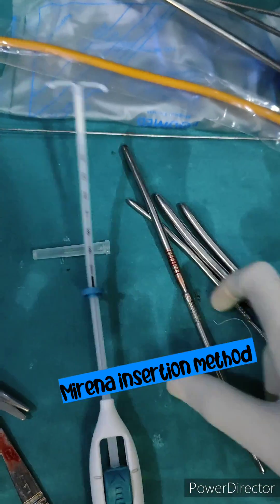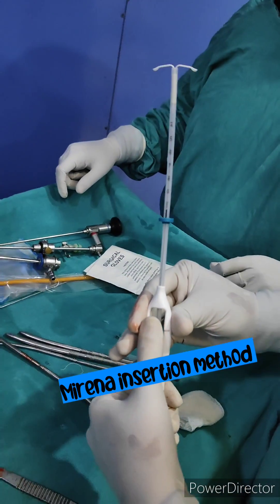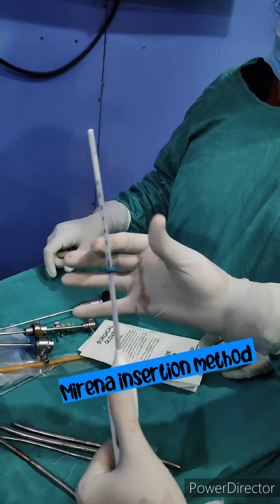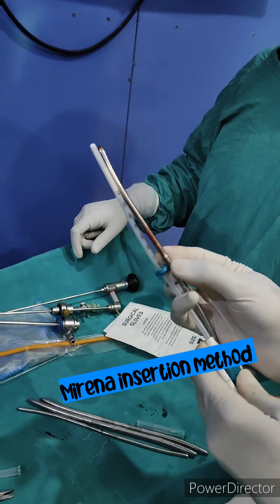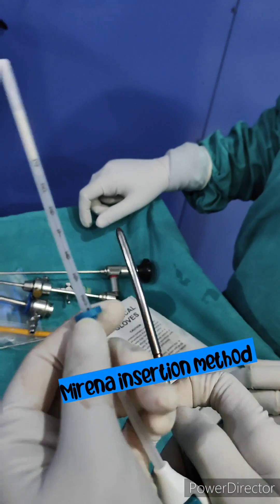First we load the Mirena. How to load: you push back the slider towards the tip. When you are pushing back the slider towards the tip, the Mirena will load. Now you can adjust the flange according to the UCL of that patient — you can move the flange up and down and set the UCL accordingly.